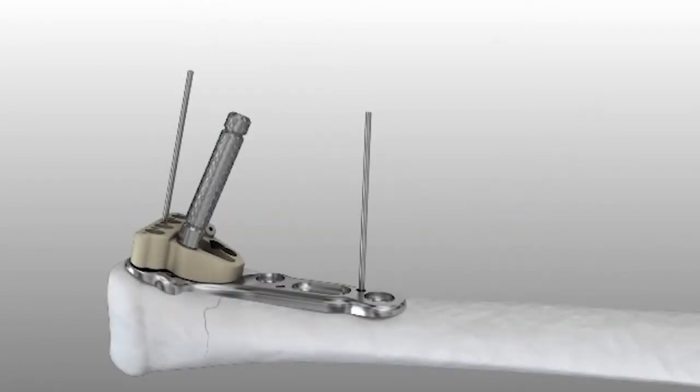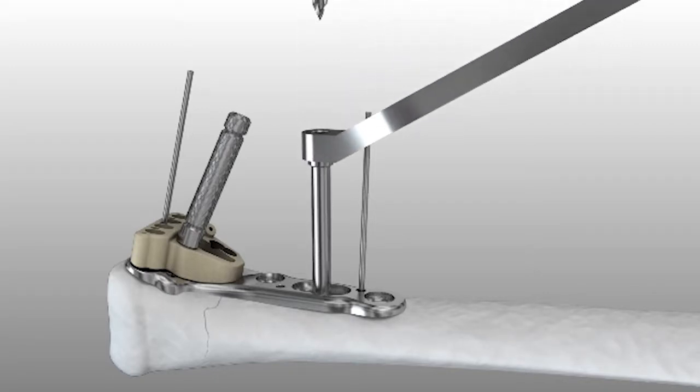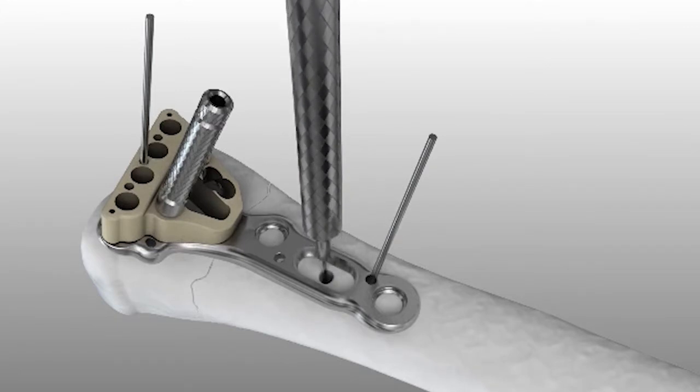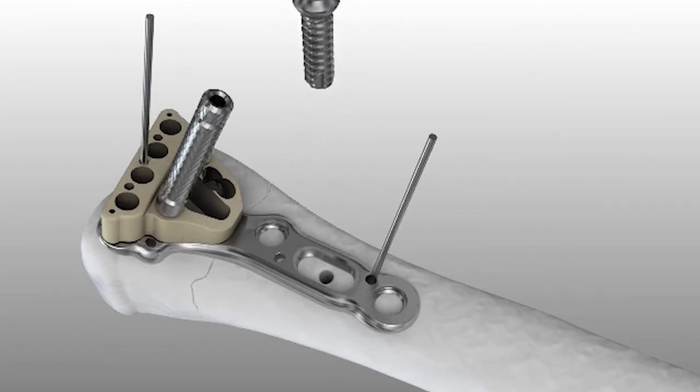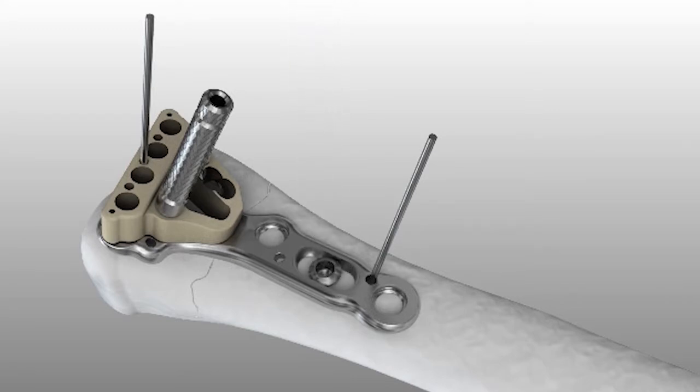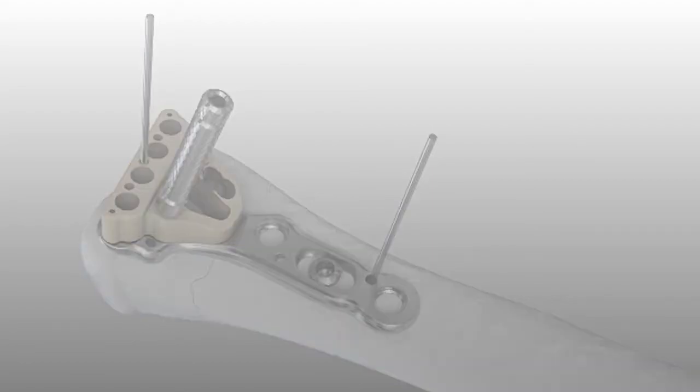The first screw to be placed is a 3.5 mm non-locking cortical screw through the slot in the plate. Using the 2.8 mm drill and the drill guide, drill to the far cortex. Drill depth is then measured with a depth gauge. Insert the appropriate silver 3.5 mm non-locking screw, taking care that the screw is the proper length. The screw may need to be downsized after the plate has been reduced down to the bone.